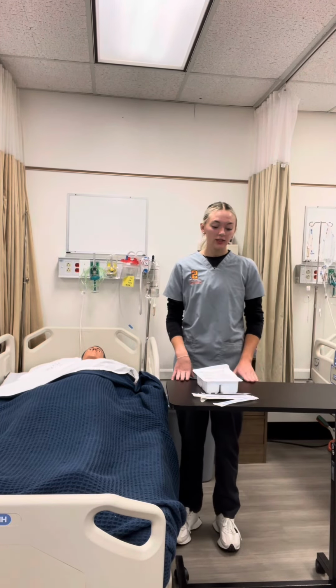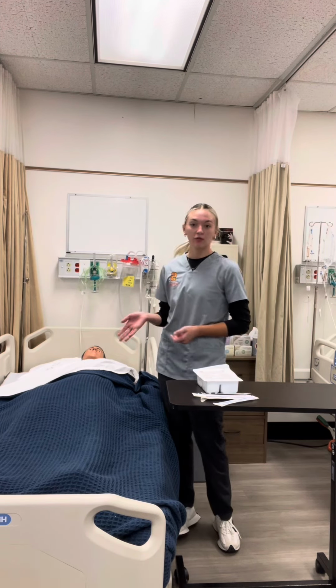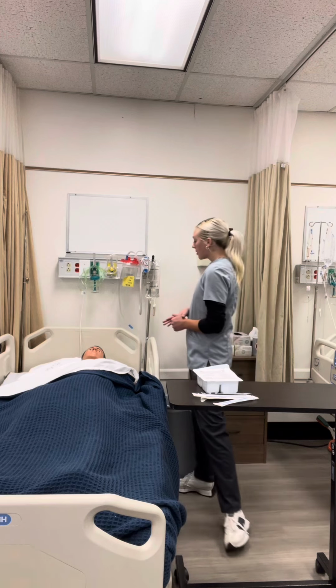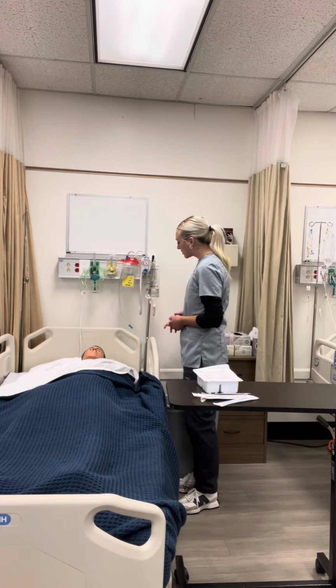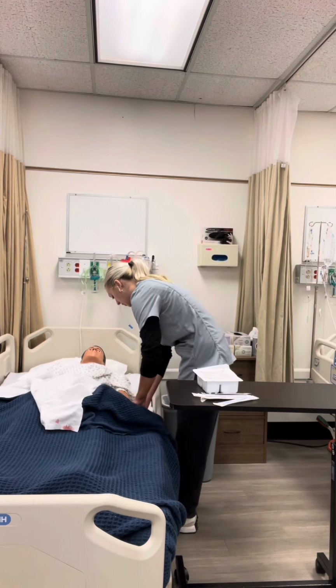Okay, I have checked the medical order and the dressing change has been ordered for this patient. So now I'm going to enter my patient's room. Hi, Mr. Jones. My name is Lainey. I'll be your nurse this evening. Would you mind telling me your name and birth date?